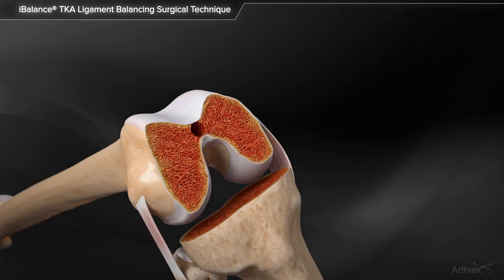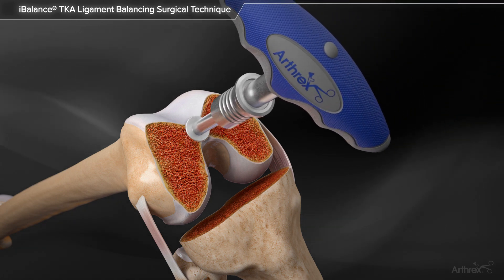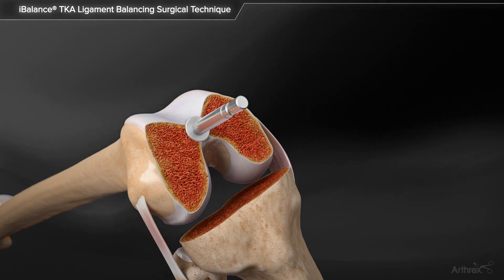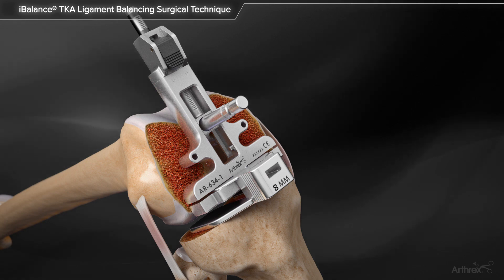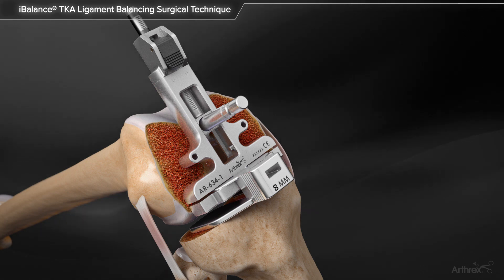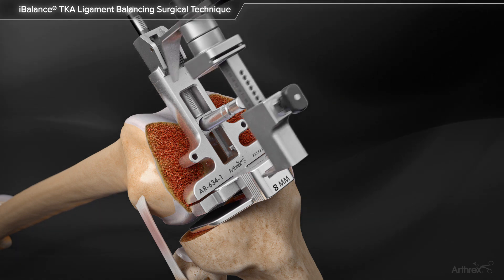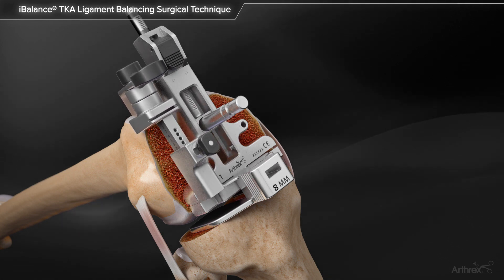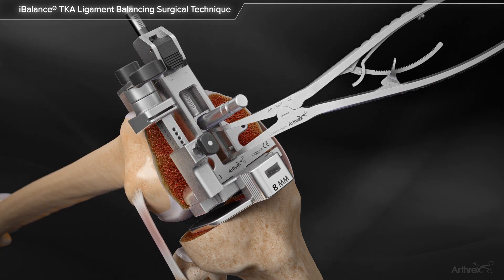Once the extension space has been assessed, the knee is brought into 90 degrees of flexion and attention is turned to the flexion space. The short-collared IM rod is connected to the T-handle and inserted into the IM canal of the femur until the collar is flush with the hole. The tensioner body with a spacer matching the measurement of the estimated poly thickness attached — 8 mm in this example — is assembled onto the exposed IM rod and seated flush against the resected distal femur. The femoral sizing stylus is inserted into the posterior cutting slot on the tensioner body and the tip of the stylus placed on the deep sulcus of the trochlea. The laminar spreader is inserted into the space directly posterior to the IM rod and the collateral ligaments are tensioned to a similar tension as the extension space.